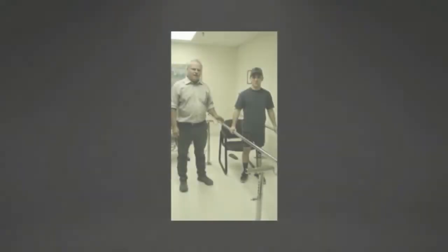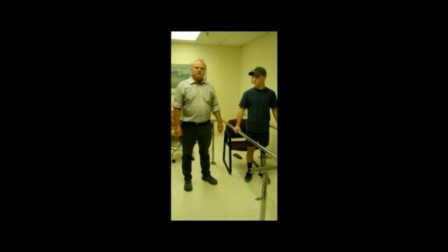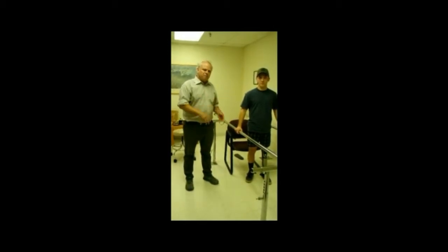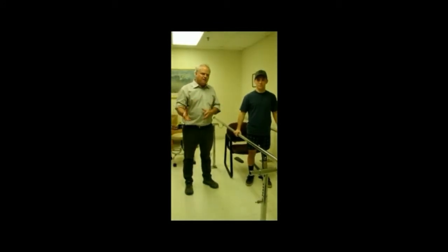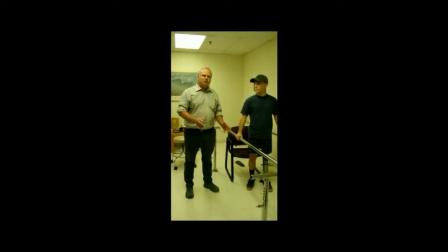This is a test socket. He did have a preparatory leg, and then they decided to do a revision on his leg. It's been approximately 6 months since he's walked. So now we're fitting the test socket, but he does have some experience with a mechanical knee that had stance flexion. I'm going to show a couple things in this video of normal, simple gait patterns that they can learn.